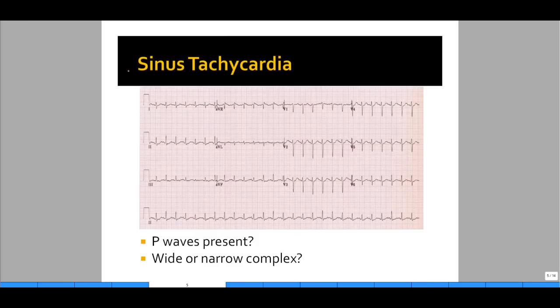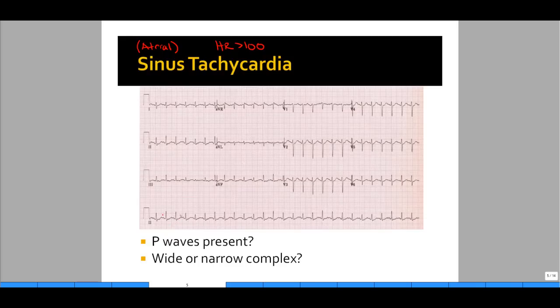The next rhythm we'll look at is sinus tachycardia. Sinus tachycardia means one, originating from the atria, and two, tachycardia — meaning a heart rate that is fast or greater than 100 beats per minute. First, identify whether this is atrial in origin. Are P waves present? Looking at this EKG, you see P waves are present before each QRS. In addition, the QRS complexes appear narrow as they are less than 0.12 seconds in width. Thus, you can say this is sinus rhythm.